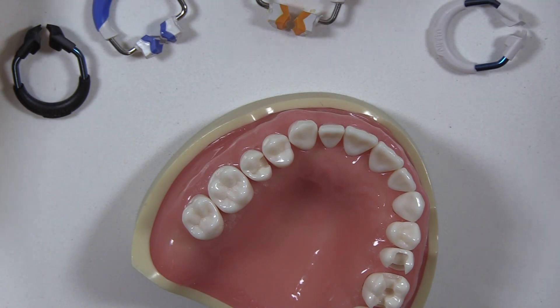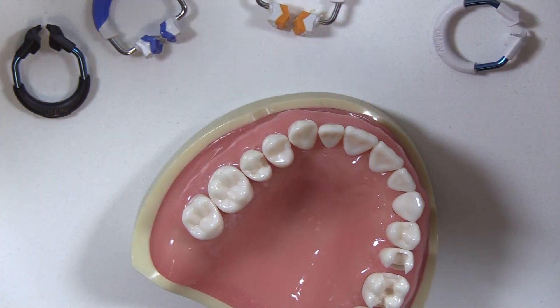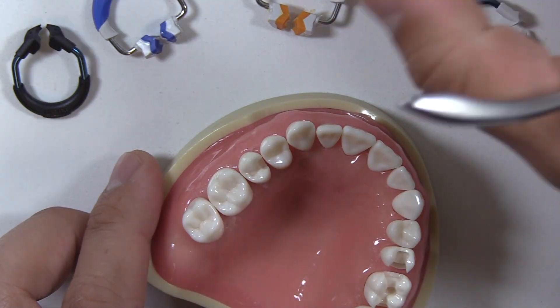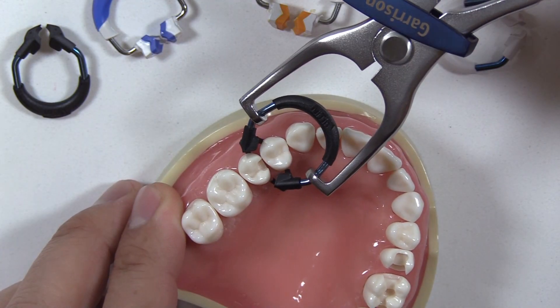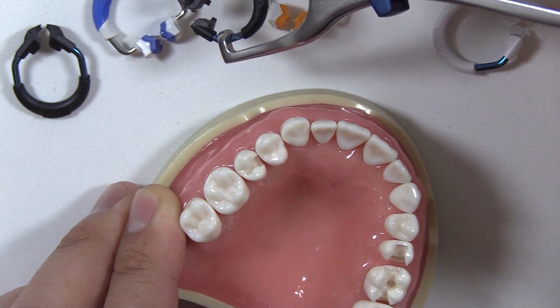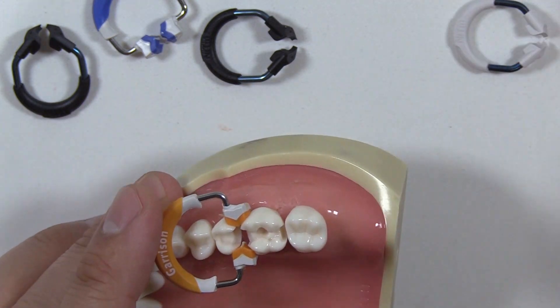As long as you have two things — for me, that's a sealed matrix. As long as the matrix is sealed to the tooth so that flowable or composite doesn't go where it shouldn't, that's important. And the second thing on that checklist is making sure you actually have contact of that matrix to the adjacent tooth. As long as those things are met and the rings fit well, we should be okay. This ring here is a little tall and doesn't sit as stable, so this might not be one I'd want to use for that area. Try it out, and have a stable of different rings so you can find something that fits well and fits your needs.